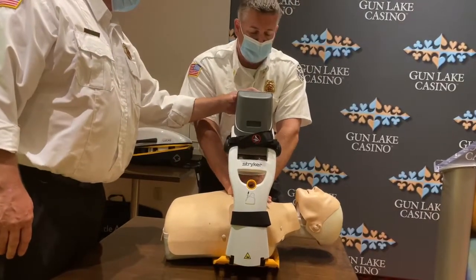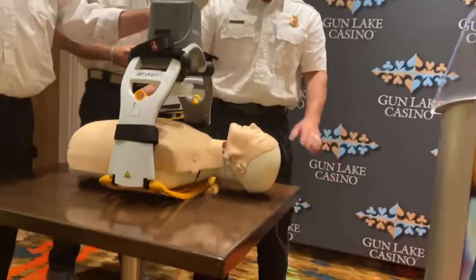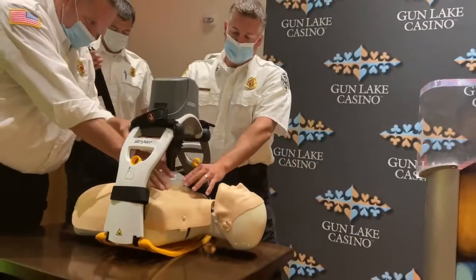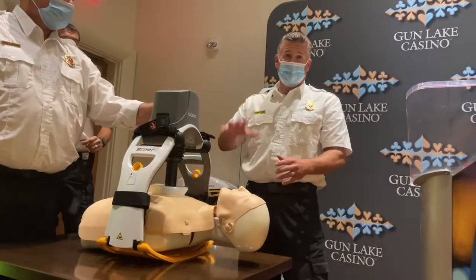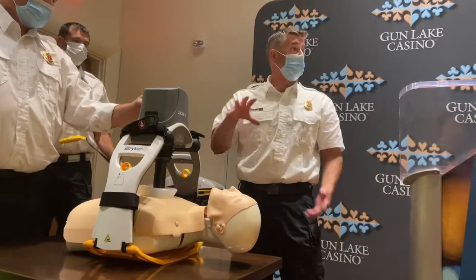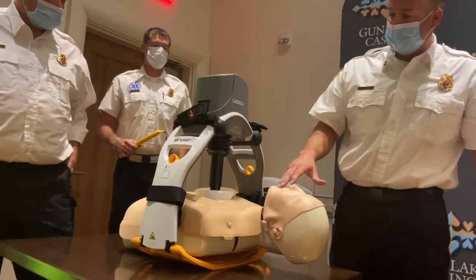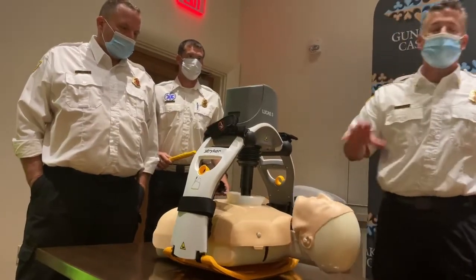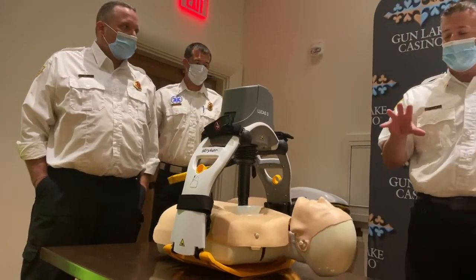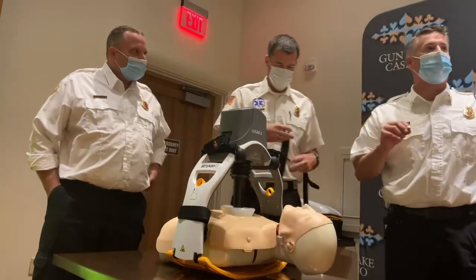What's really cool about the Lucas device is it's intuitive. So depending on how big the person is, you would fit it to the chest. It will take about three to four compressions to learn the size and depth of the person, and at that point it's going to go through its first cycle. Now it knows it's going to do 110 compressions every minute at an exact depth of 2.1 inches.